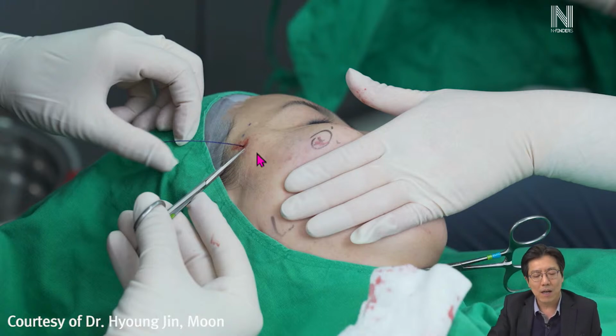So the first step, you can ask your patient to smile with maximum effort when you cut the threads, or you can ask the assistant to push up the mid face as much as possible. After that, you can cut the thread. In that case, you can prevent the complication, thread extrusion, when the patient makes an expression.